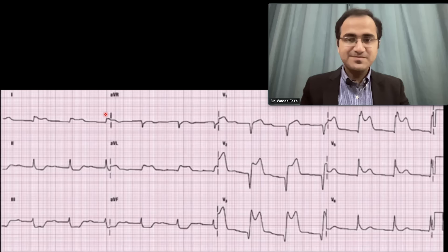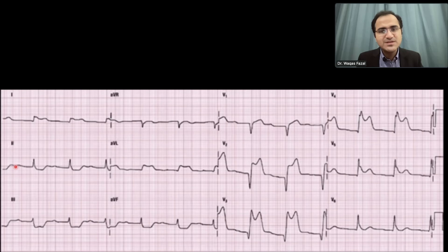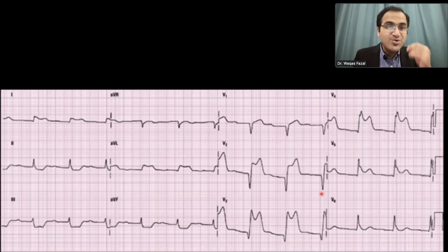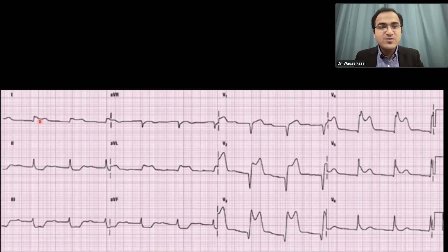When solving ECGs, always go through the leads systematically from lead I to lead V6 so you do not miss anything. Never jump directly to a specific lead. This systematic approach is the purpose of the six-step method we have learned in this ECG series.